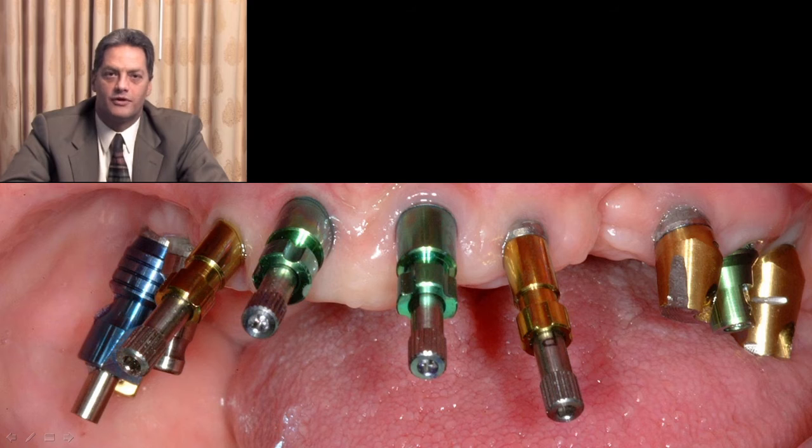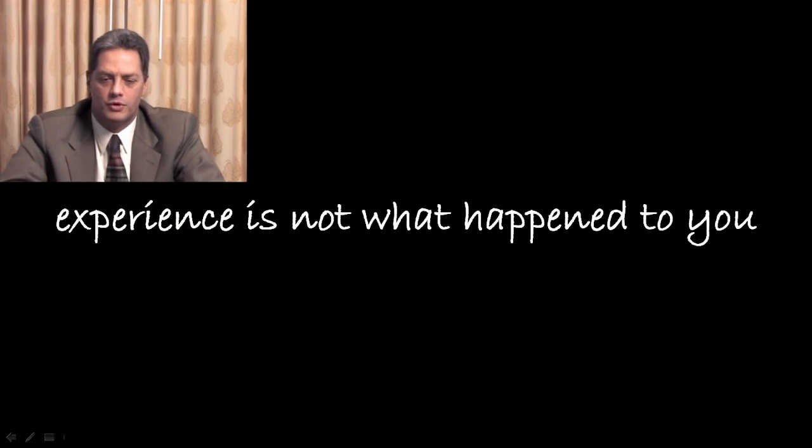And try to avoid this type of scenarios. Here we have implants that are actually integrated, but this is not the way we envision to restore this case. And the patient is demanding to have a final prosthesis that is going to be screw retained. So while we're very thankful to the referral guy, we cannot thank him for the problem he has given us. In order to take a good impression, we had to use angle abutments on the upper left side of the patient to create a path of removal of the impression post.